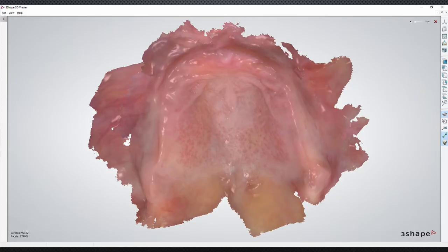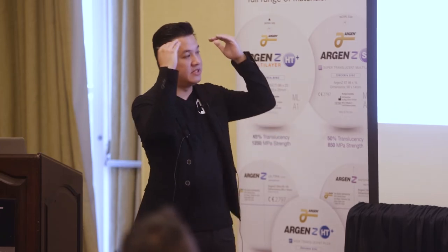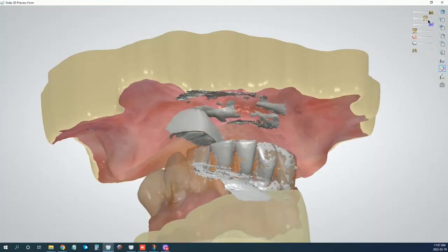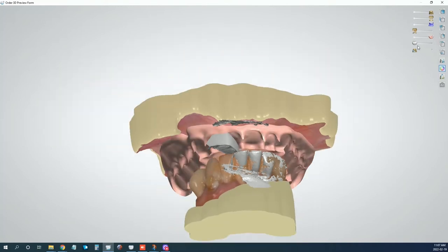So yeah, of course, a lot of this comes down to the skill of the clinician who's using it. 3Shape has, of course, a protocol for scanning these dentures, but the person scanning really has to know how to displace all these tissues and scan following that protocol. But he sends it to me, and I get this, and it's literally a sheet of folded up base plate wax, and those are the teeth I had to work with. And he goes, can you please make this to finish?